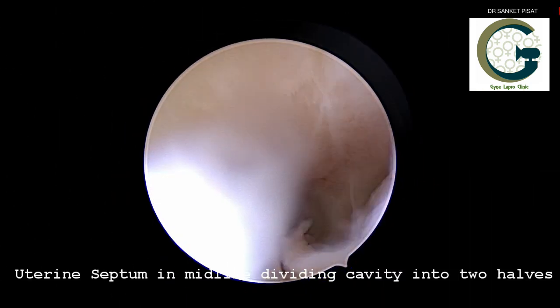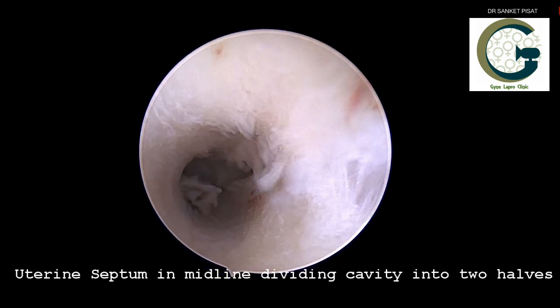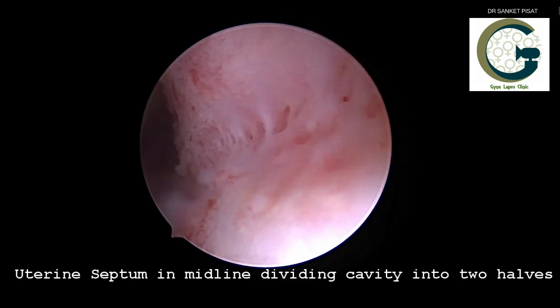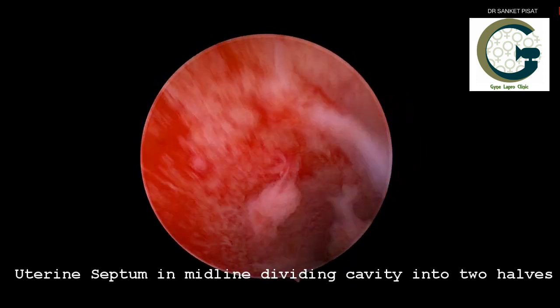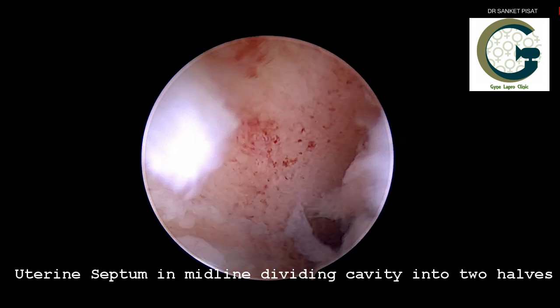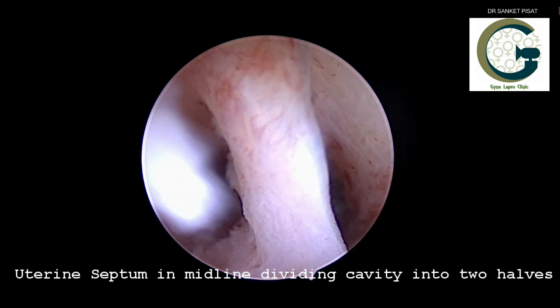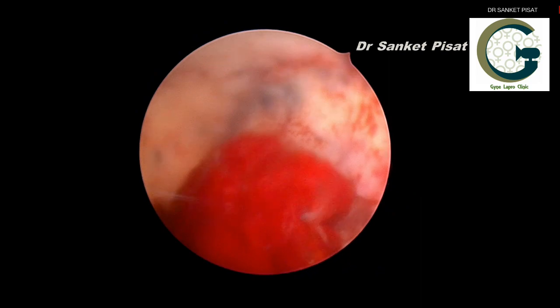However, in this patient, there is a large uterine septum in the midline dividing the cavity into two halves. This is the left half of the uterine cavity and on the other side is seen the right half of the uterine cavity. These two halves are completely separated by a vertical septum which is a fibrous band dividing the uterus into two vertical halves.